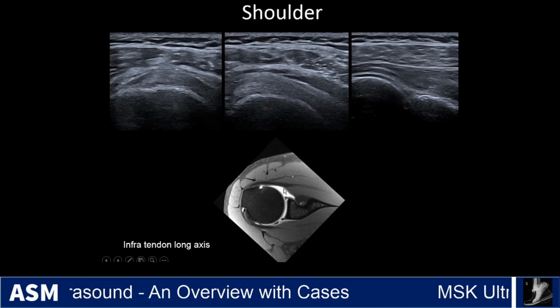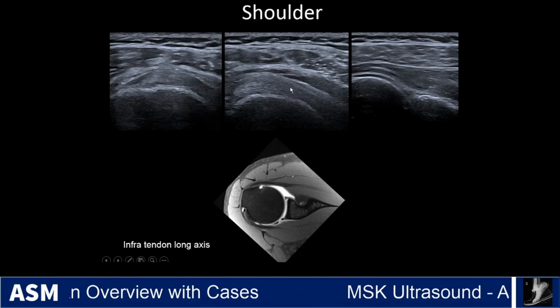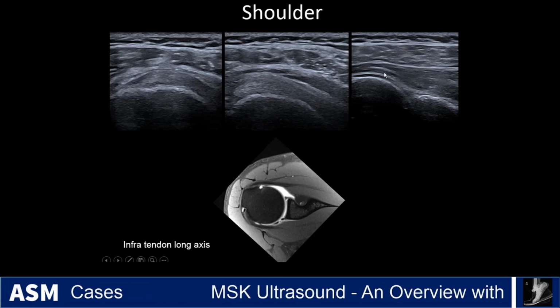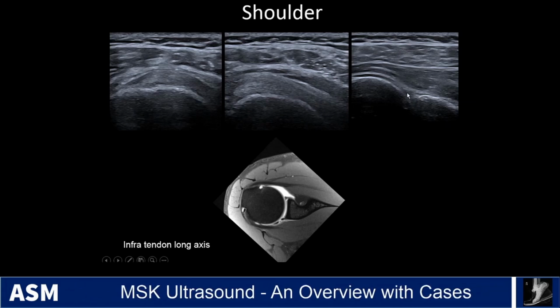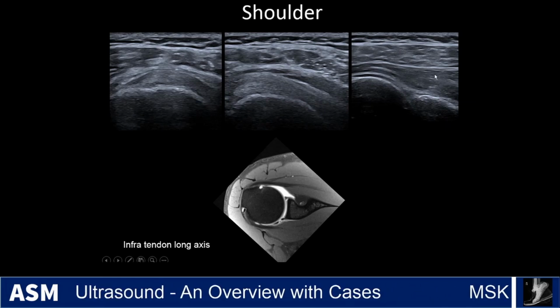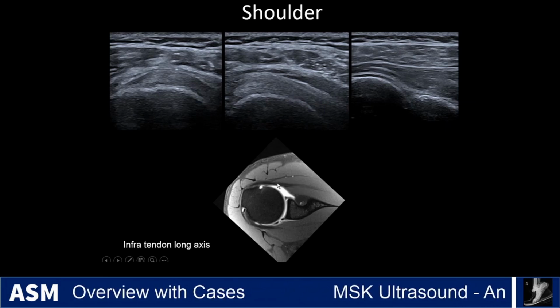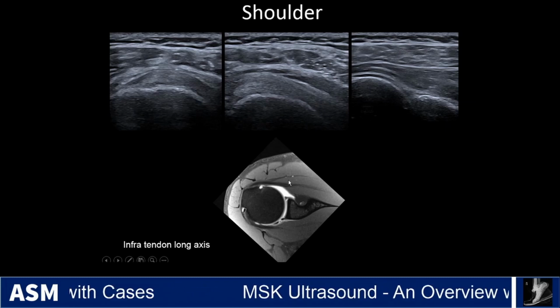and you're coming across. This is a different patient from an arthrogram, but as you're sliding across, you're getting more towards the mid-substance, and if you really keep coming back, you're going to get into the proximal part right near the joint. And so you can actually see here's the glenoid right here, the posterior labrum right here, the humeral head, a little bit of cartilage, and you can start to see the muscle coming into play in here. So this is the muscle back here, again at that junction of tendon, this dark or hypointense area, and then the muscle around it.